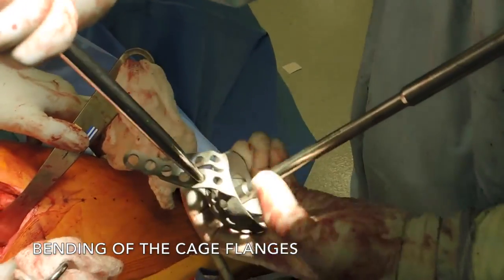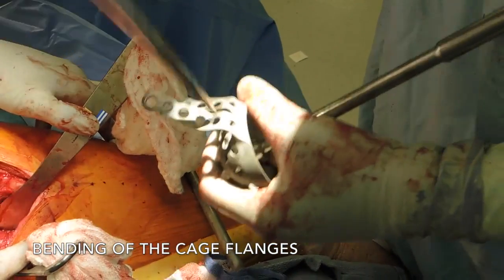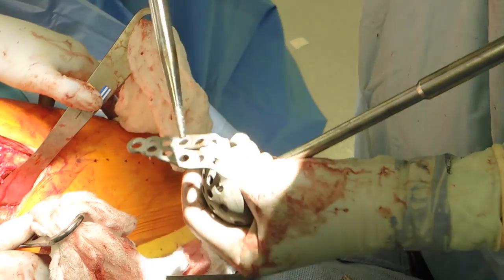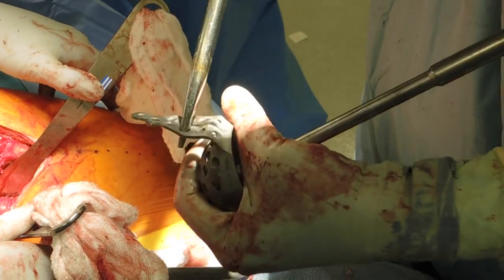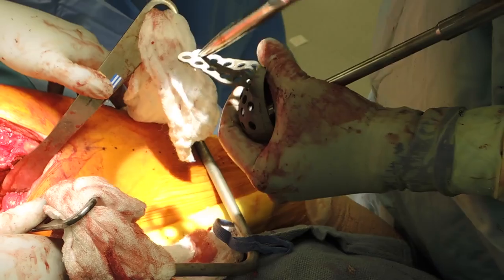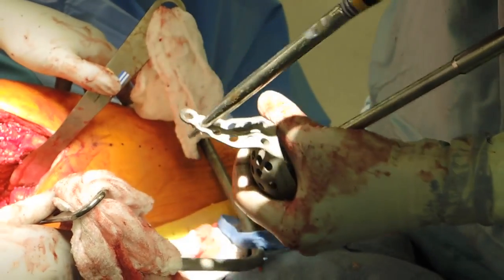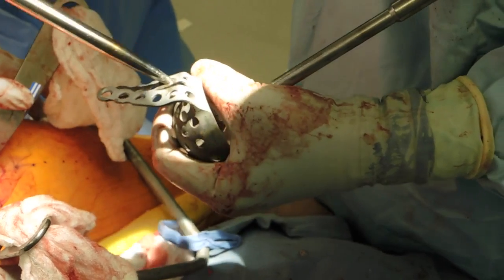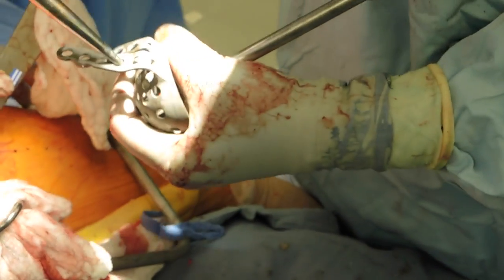This video demonstrates the cage implantation. We will start by bending the flanges of the cage to fit the ilium. We place the inserter into the center hole of the cage to stabilize it. Then we used a round narrow tip tamp to bend the flange holes to fit properly to the side of the ilium. Exact fit is not necessary as the screws will help suck the flanges down to the bone.